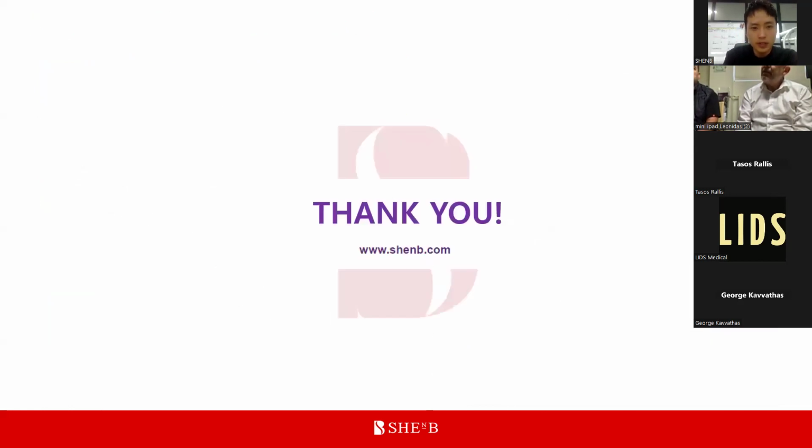Okay, so this was a brief information about the troubleshooting, and as I have emphasized during the troubleshooting, I again want to emphasize that where we attach the tip, we always have to put on the cover on top. That's the main part.